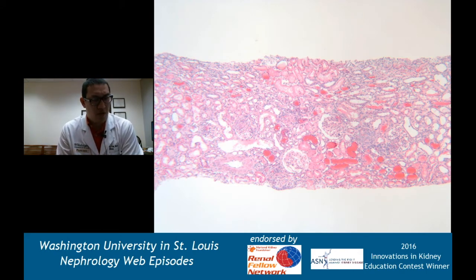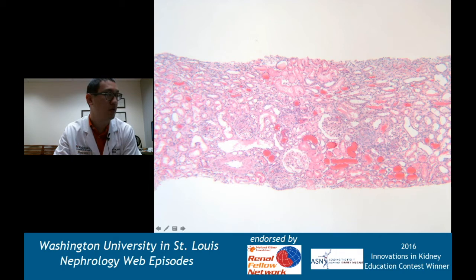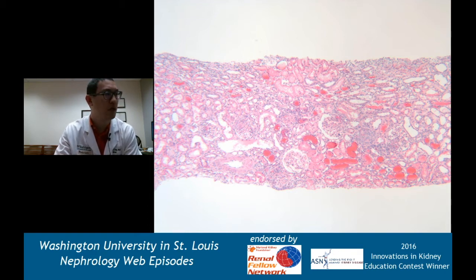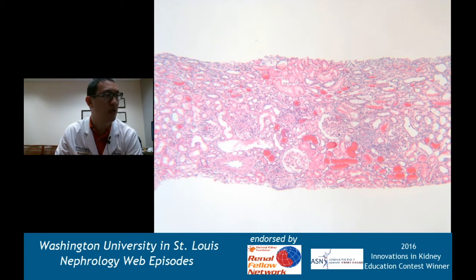This is an H&E stain - again, a nice sample. We can see at least six glomeruli. The glomeruli don't look totally normal. What you can also see here are red blood cell casts within the tubular lumen. There's pretty preserved interstitium and tubules - not a lot of atrophy, not a lot of fibrosis. Again, that's a good sign.